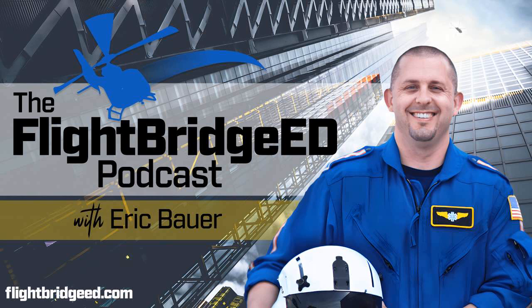FiO2. So let's talk about FiO2. You can have low tidal volumes, and you can have a higher respiratory rate, and you can have an average PEEP, and use FiO2 and PEEP to your advantage. What it's called is a PEEP FiO2 slide. And if you do this in conjunction, you're going to greatly improve oxygenation. Remember though, oxygen is a biological toxin, and the body doesn't need high amounts.